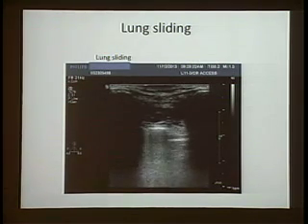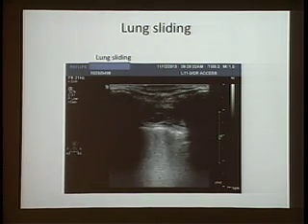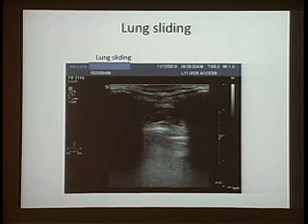Okay? Remember that when your patient is supine and there's air in the cavity, the air will go to the top. An x-ray may miss it altogether. You get an x-ray, you're going to see lung parenchyma underneath if it's a small pneumothorax, and you may miss it altogether. Echo will allow you to make the diagnosis right away.